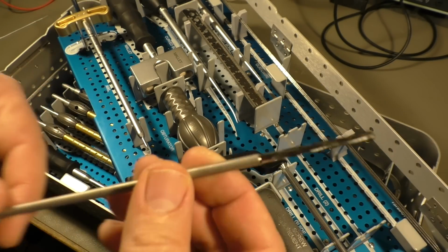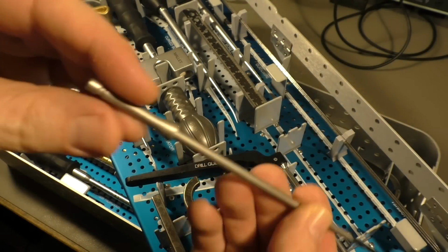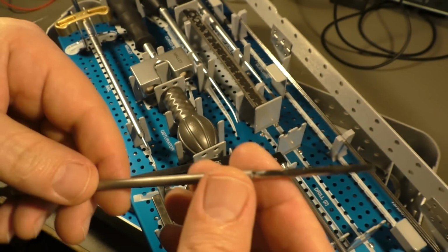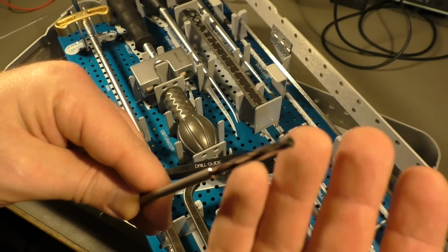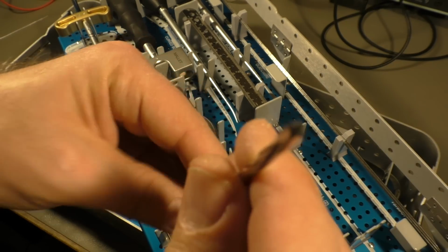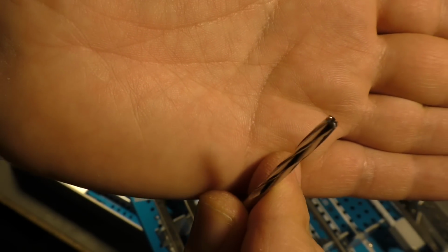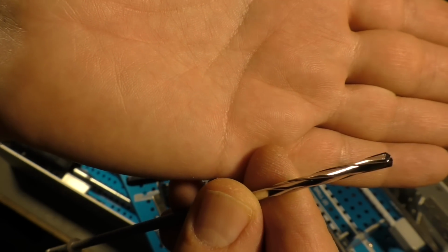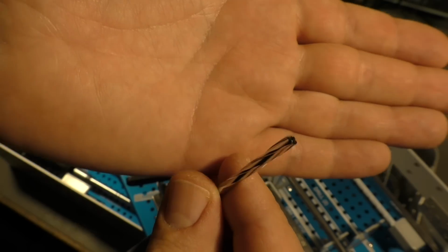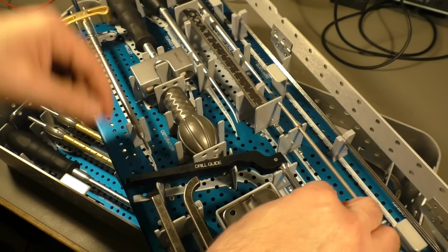Then we have drills, like this one. They are hollow, there is a hole through the drill, so I assume it's used together with water that flushes all the drill dust away. It's also quite a different tip. It's made to drill bones, of course. So the tip is quite different from steel drills or wood drills. So this is specialized equipment.